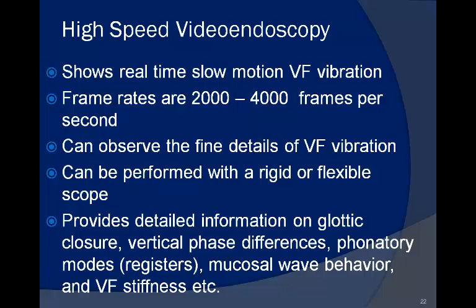For many years, high-speed video has been used primarily for research, which has provided us with a better understanding of the finer details of vocal fold vibration that could not be obtained via video stroboscopy. Over the years, advances in technology have made high-speed video less cumbersome and the light source somewhat less hot. High-speed units are now available for clinical use and are used by some laryngologists in place of video stroboscopy. The clinical application and use of high-speed in our field will most certainly increase in the coming years.